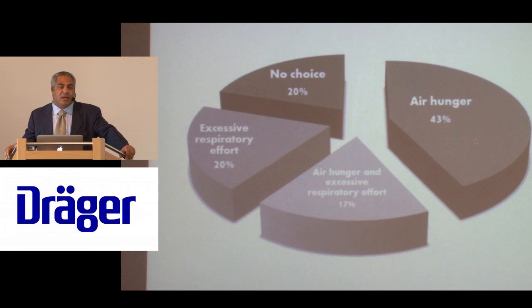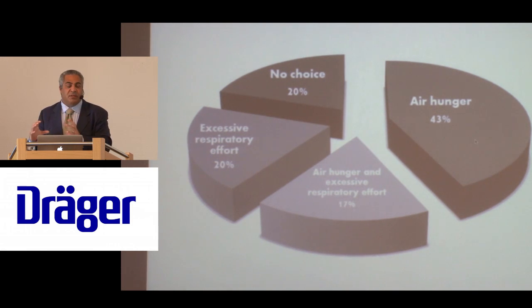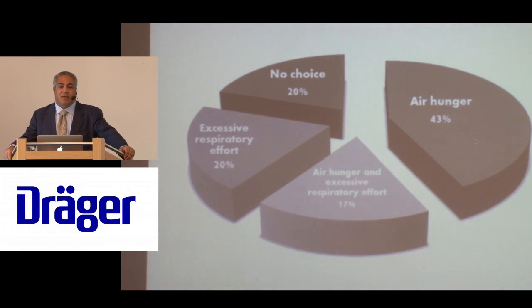And so if the patient's metabolic rate changes, let's say at 2 in the morning, while we're all asleep at home, the patient becomes septic, has a fever, their metabolic load doubles. Even if they looked good before you went home, they may have a completely different desire to breathe at that point. So if we have zero flexibility in our settings, then the patient cannot adjust their breathing to our settings. And of course, typically, at least in the United States, what would happen is if the patient disagrees with our ventilator settings, we make sure they agree by sedating them or paralyzing them. So now you must accept what we set.